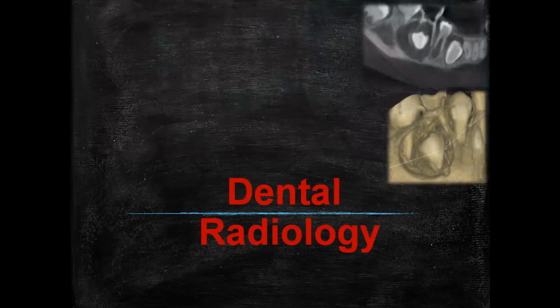So before we start, we need to understand what role dental radiology plays in our day-to-day clinical practice. Dental radiology, whether it includes IOPAs, RVGs, OPGs, or CBCT, plays a pivotal role. When in doubt about diagnosis, you take an X-ray, you get a diagnosis. When in doubt about the treatment procedure, you take a CBCT, you get an answer. So it plays a very important role.